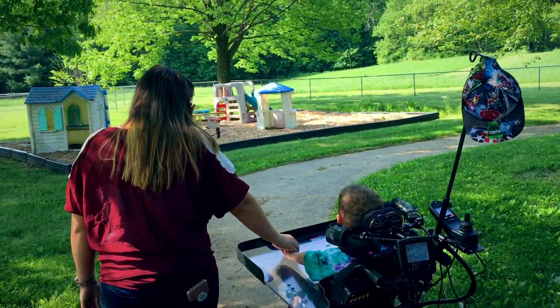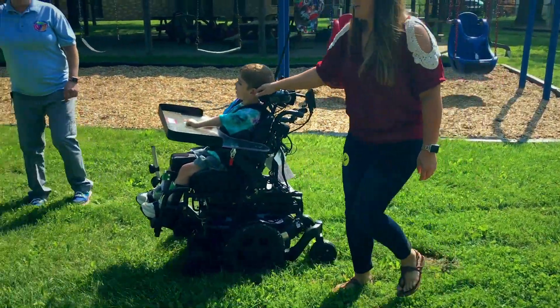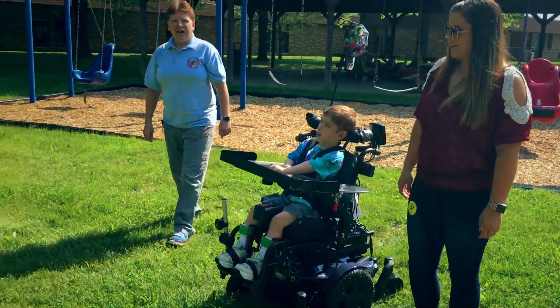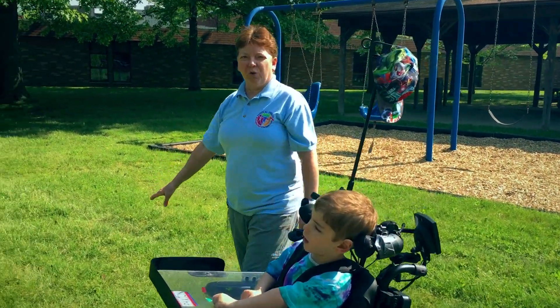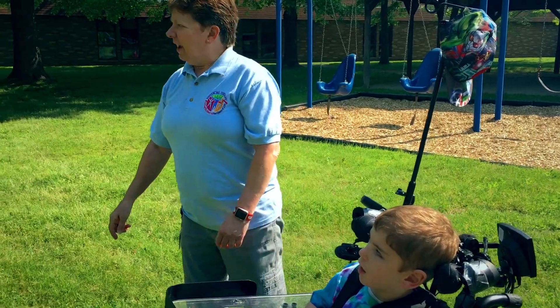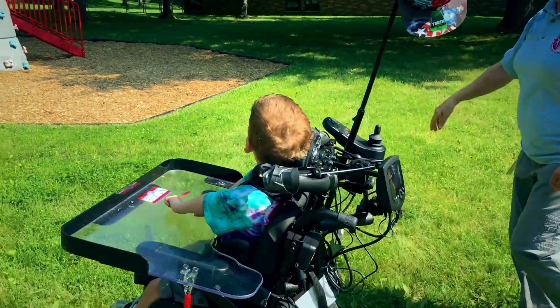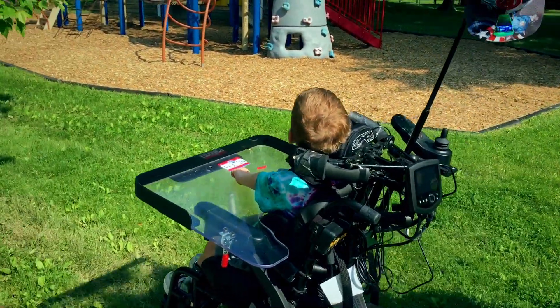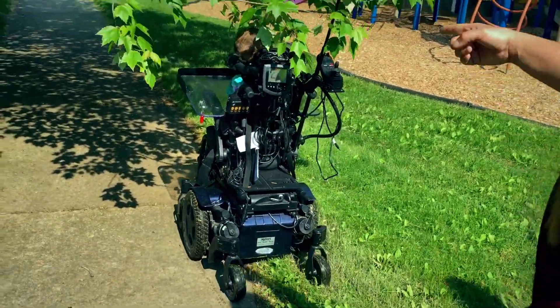Sissy just loves it — she wants to take rides on it. We have a special kind of mulch here at the playground called 5R, so you can actually drive a wheelchair over that surface. It's not like normal mulch — it's cut differently, so he can actually drive up here. And the other side of the play structure is ramped, so he can actually drive up on top. We do have to be a little cautious because of his control where he drives on the play structure.